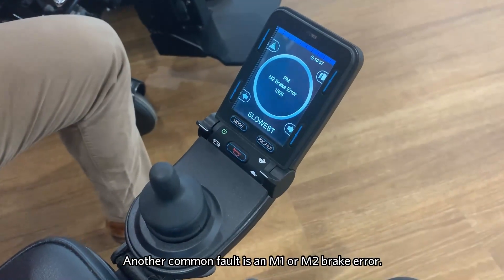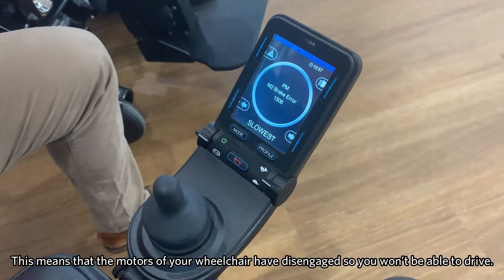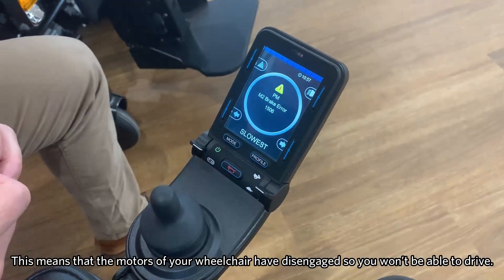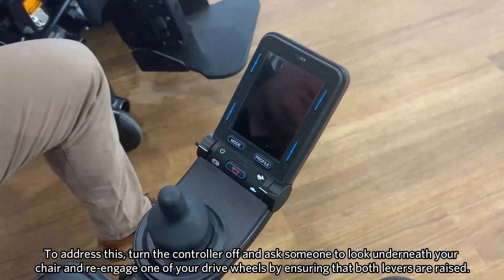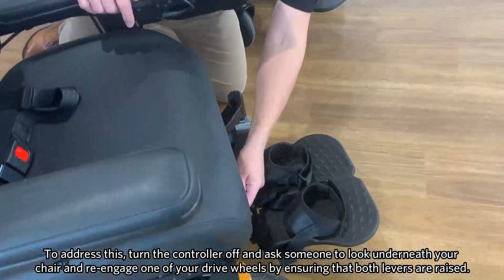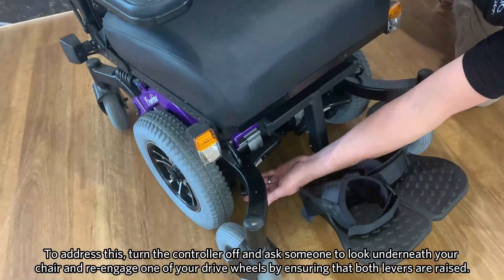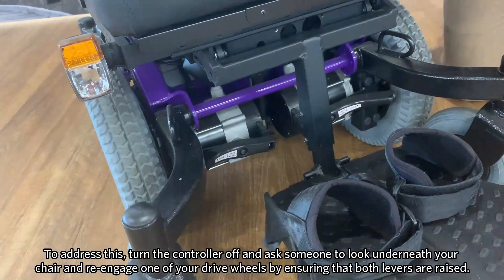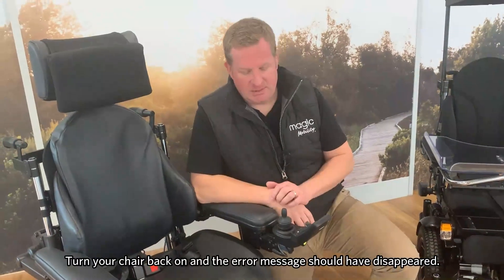One of the other common faults you'll find on your controller is an M1 or M2 brake error. What this means is that your motors on your wheelchair have been disengaged, so you won't be able to drive. To address this, simply turn the controller off and then work your way under the chair, have one of your carers re-engage one of your drive wheels, and just check they're both engaged while lifting the levers. Then turn the chair back on and you should find that that error message has disappeared.